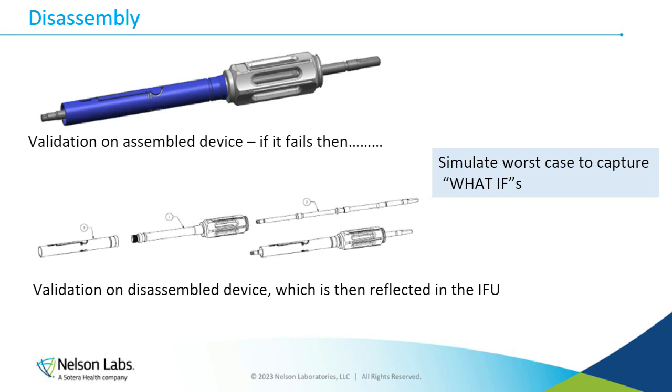It's very well defined and it's in the IFU. So we see this a lot as well. And a lot of times manufacturers like to validate them in a non-disassembled state, just in case users forget to disassemble. But oftentimes with these type of designs, we do ask for disassembly.